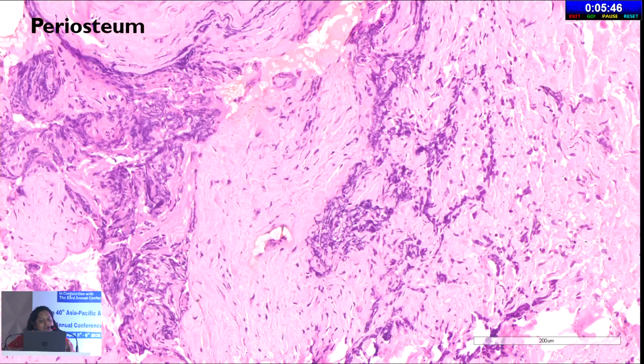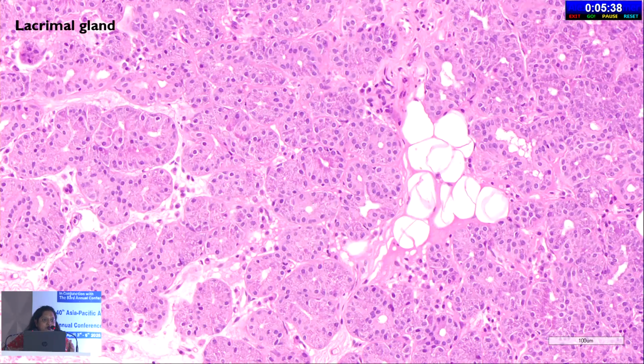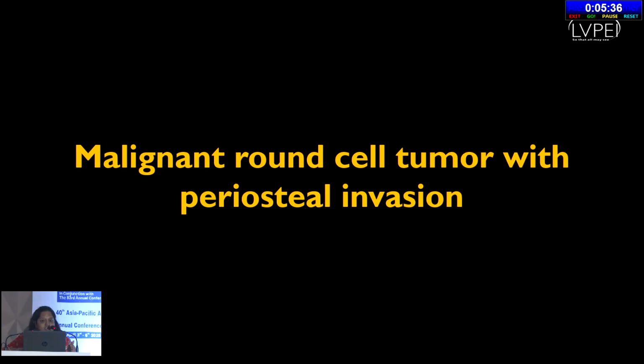The adjacent periosteum and the lacrimal gland were sent as well, and the periosteum showed involvement by the tumor, whereas the lacrimal gland was absolutely free of the tumor. So this was provisionally called a malignant round cell tumor with periosteal invasion.